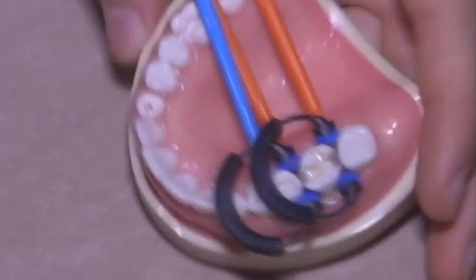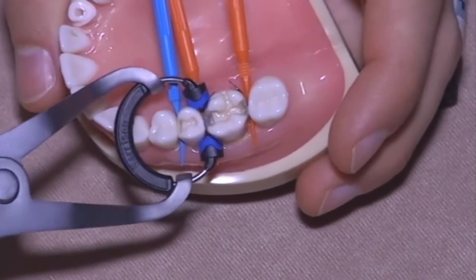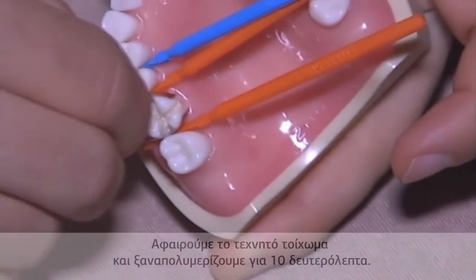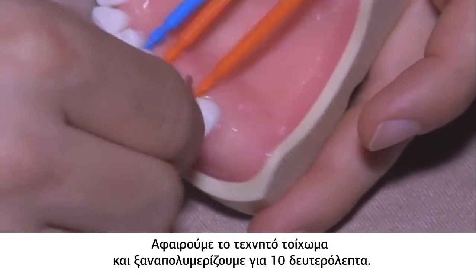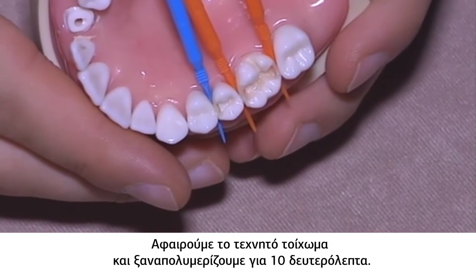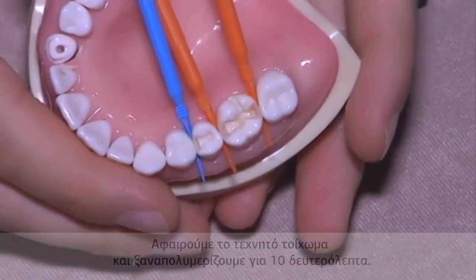Okay, and we're gonna remove everything. Here we are, and we have the 3 walls. Now we have 2 first class, and it's easier to proceed with the restoration.